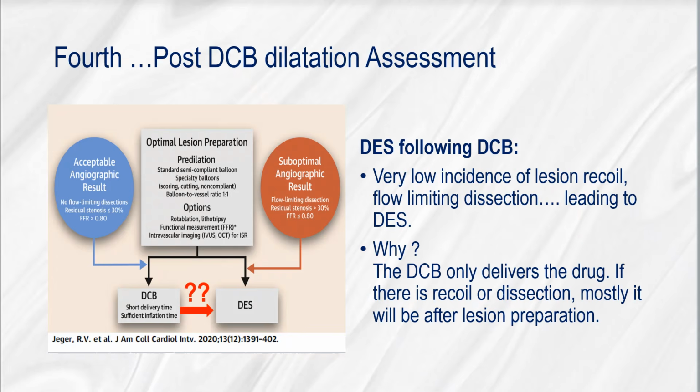The fourth step is post-drug-coated balloon dilatation assessment. There is very low incidence of lesion recoil or flow-limiting dissection leading to drug-eluting stent implantation. The drug-coated balloon only delivers the drug. If there is recoil or dissection, mostly it will be after lesion preparation.